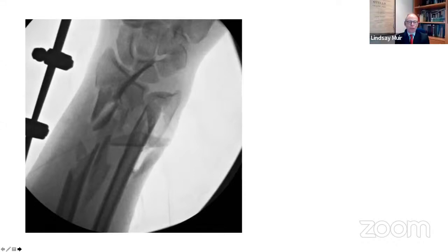Goodness. Well, the injury is confined to the radius. I know there's an ulnar fracture, but probably we don't need to worry too much about that. And there's no carpal injury, and I'm assuming there's no injury proximal. So probably some form of, it needs to be a very long plate, and span it and try not to disturb the soft tissues too much. That big fragment there, in between the radius and the ulna, probably still has some soft tissue attached to it. So I might try and stick that back and span it with a locking plate, would be my thought.